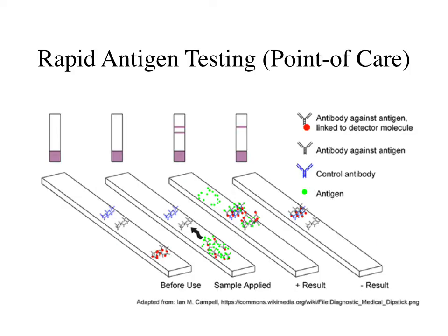So there's rapid antigen testing. These are the point of care tests. Rapid antigen tests are immunoassays that require respiratory specimens, typically nasopharyngeal or nasal swab, from the patient because COVID-19 is a respiratory virus. Once collected, samples are placed in an extraction buffer or reagent and tested for the presence of COVID-19 specific antigens. The rapid antigen test tells us if a patient is actively infected with COVID-19.